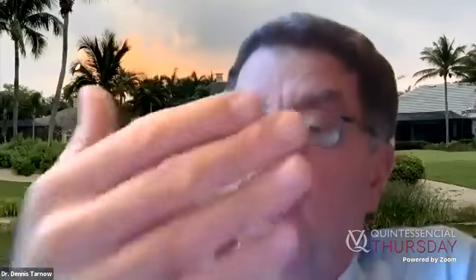I call it a dead space, but it fills in with connective tissue, like what Thomas showed in that last case. So understand that you don't want a knife edge sticking right up. That's on the contour, and you get more tissue. Creating that space by having a bulge that comes out actually creates a dead space. But if it's all flat, you have the risk of the whole thing collapsing in too much. You want to create that dead zone for tissue to fill in during the healing phase, like Thomas so clearly showed.